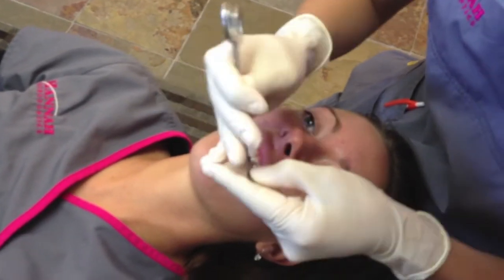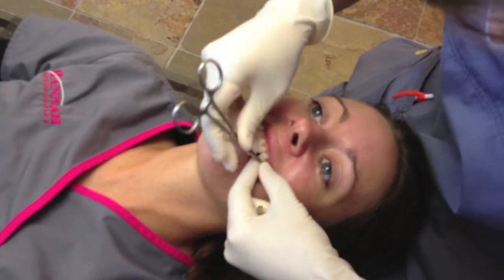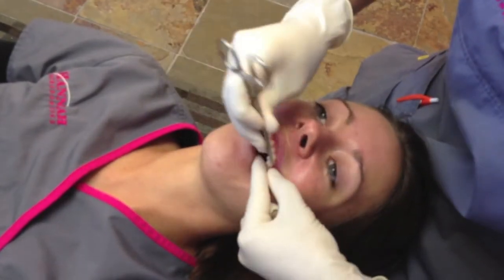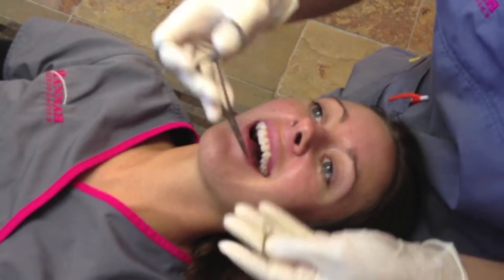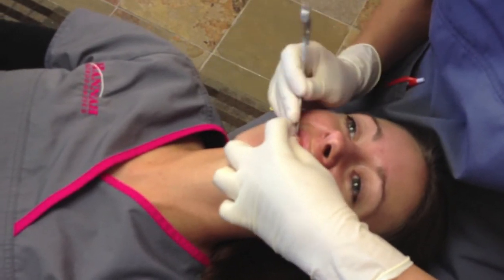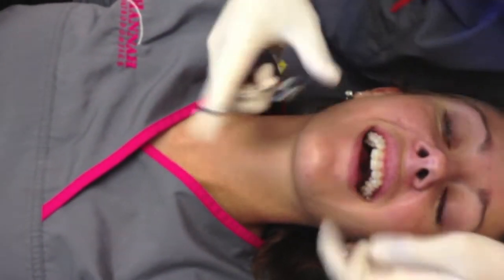Are those different colors that people get to pick? Yes, and in this case Katie chose smoke — it has a little tint to it. They're not exactly clear, but they don't stain as fast as the clear ones. They also come in all the other fun colors — all those rainbow colors that you see. So where there's a little bit of crowding and where this tooth isn't in full alignment, this is probably where she'll have the most discomfort.